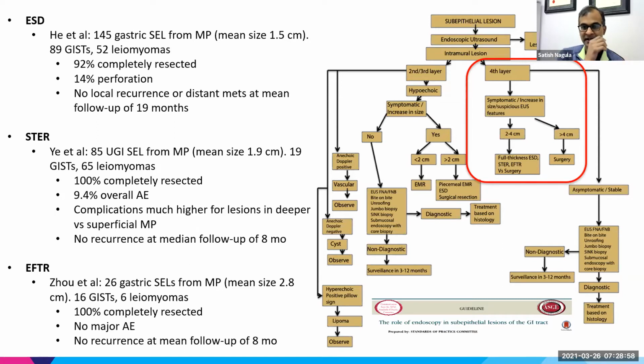In terms of, and I like this ASGE algorithm a little bit. Myself, I was a skeptic about having these GISTs removed with ESD or EFTR. I initially, a handful of years ago, thought this was just endoscopists showing off. These are low risk lesions. But now, having worked with Nikhil and also seen the data evolve over the years, it's quite safe.